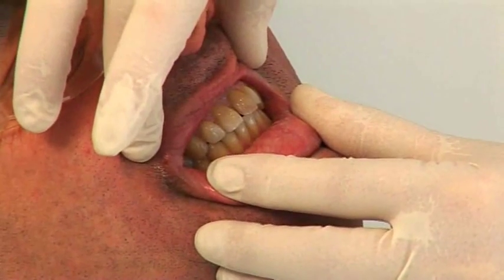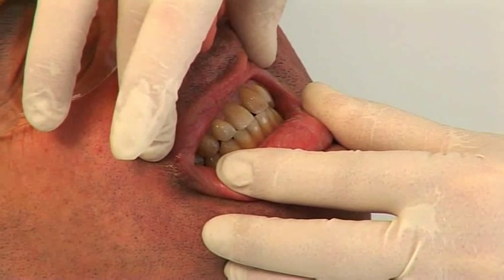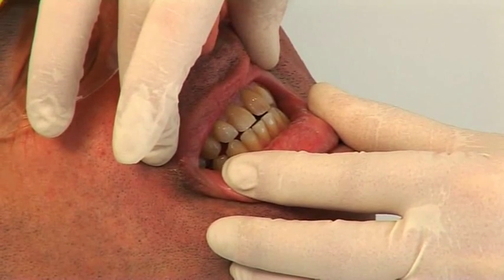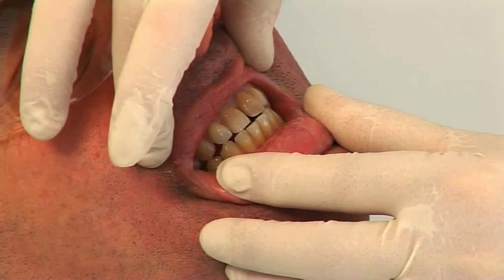Now what I want you to do is just very slowly move forward until I say stop. Keep going. Stop. So we've achieved some forward movement of the mandible with no deviation.